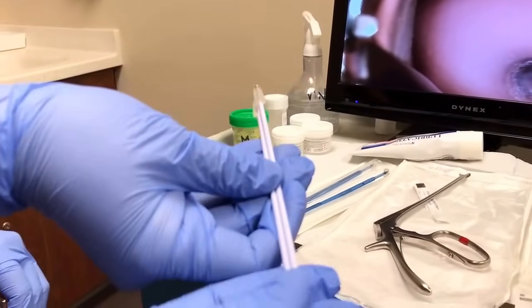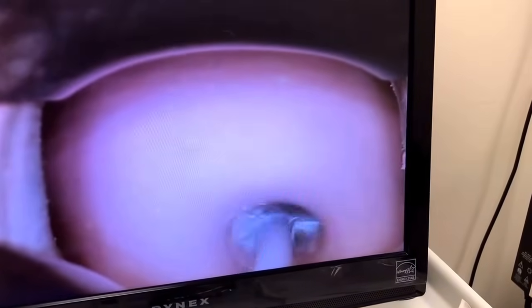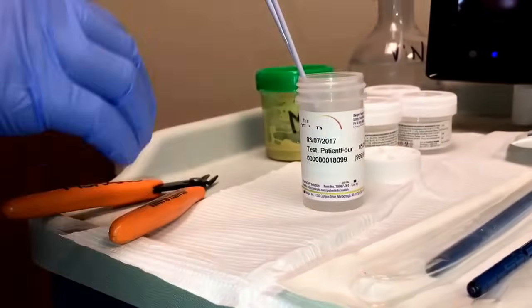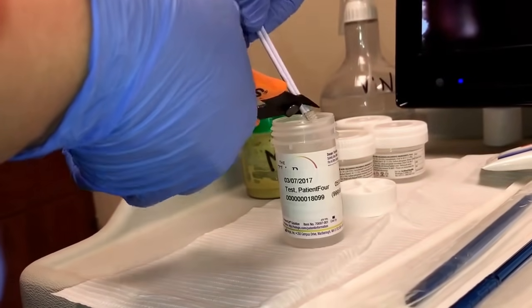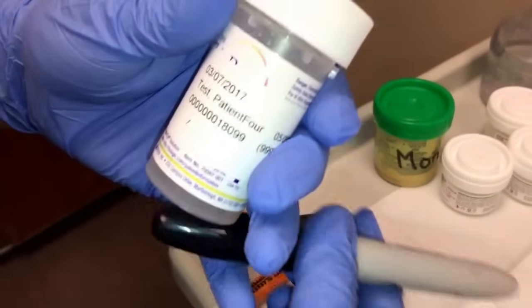The MA will then give the provider the ECC swabs. After the ECC biopsies have been collected, they will be passed to the MA, where they will be placed into the thin prep vial and cut with the wire cutters. When that has been cut and the vial is closed, it will be labeled ECC.